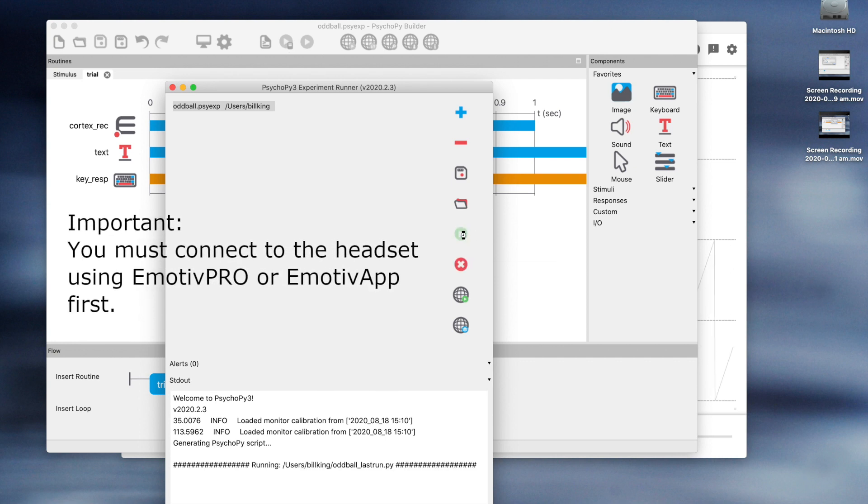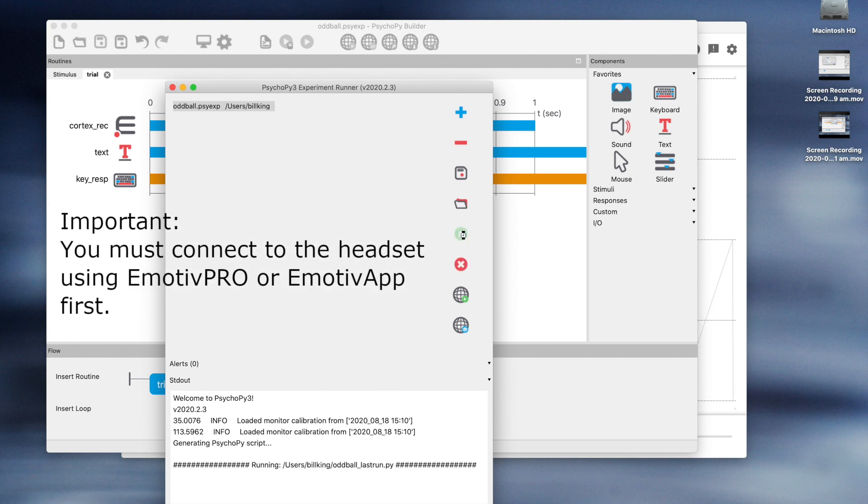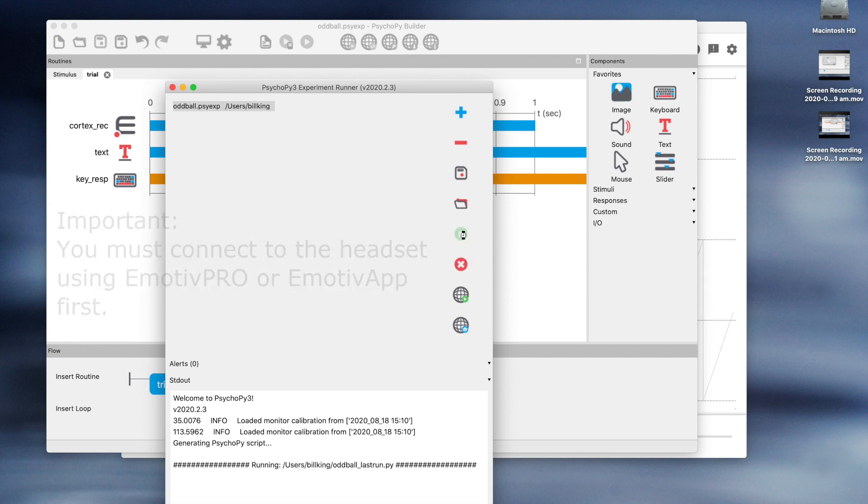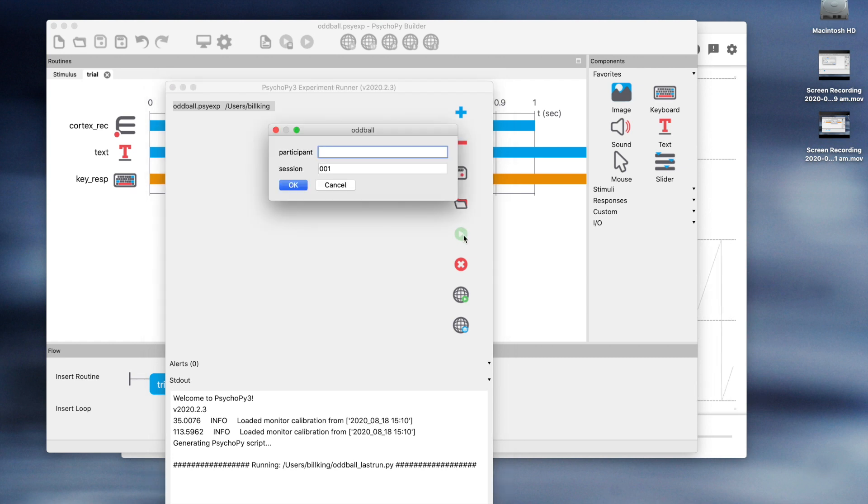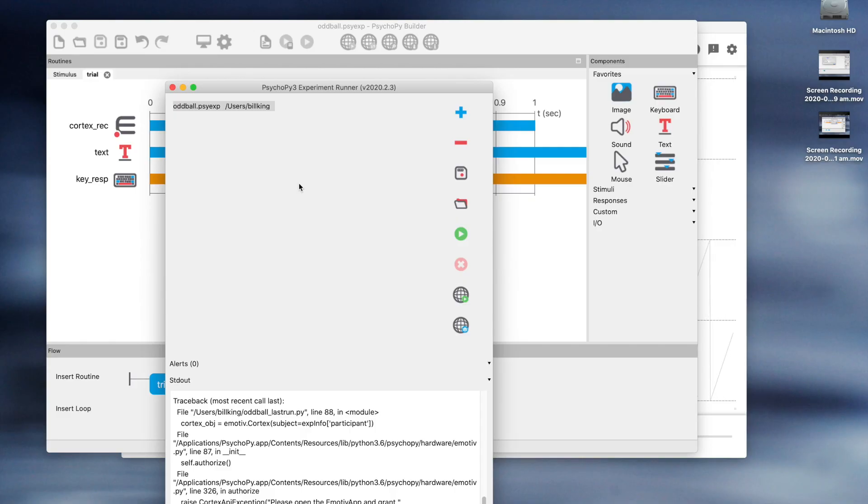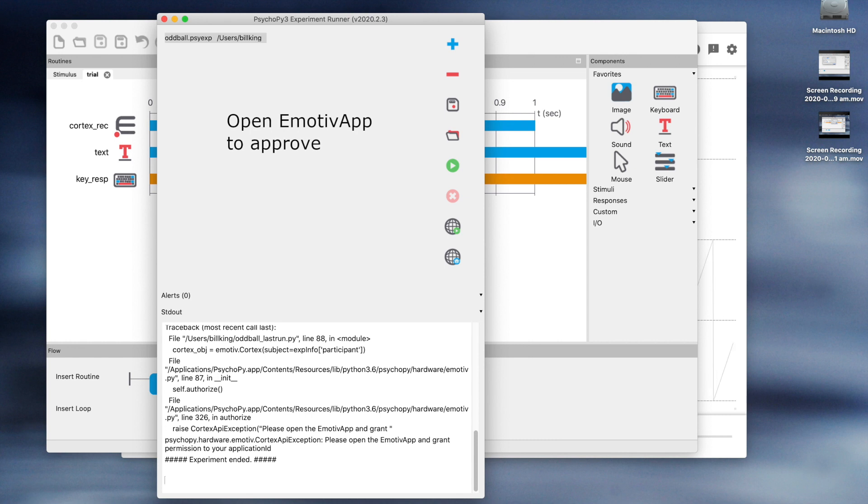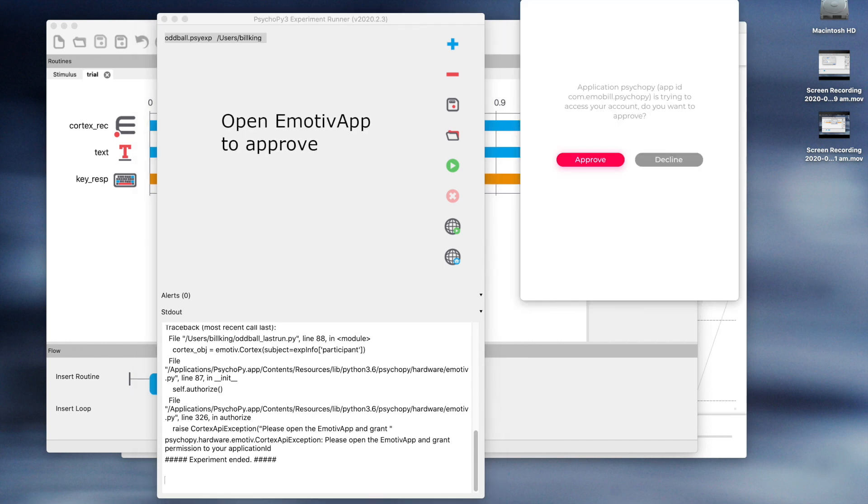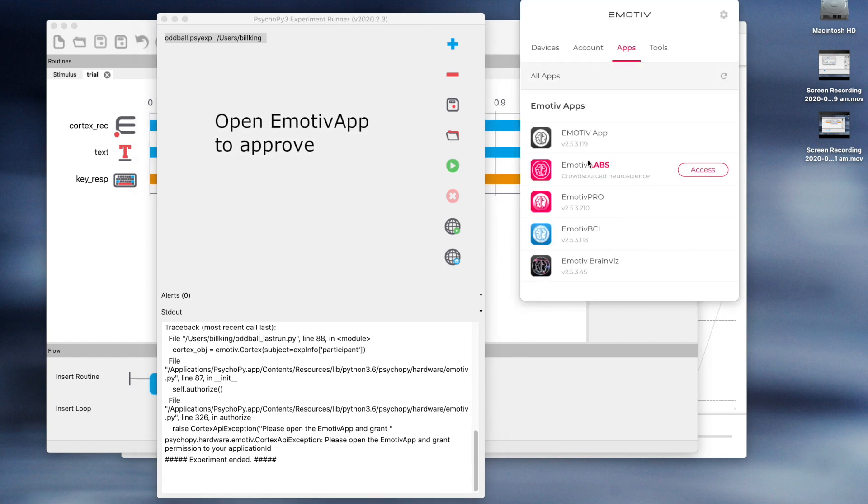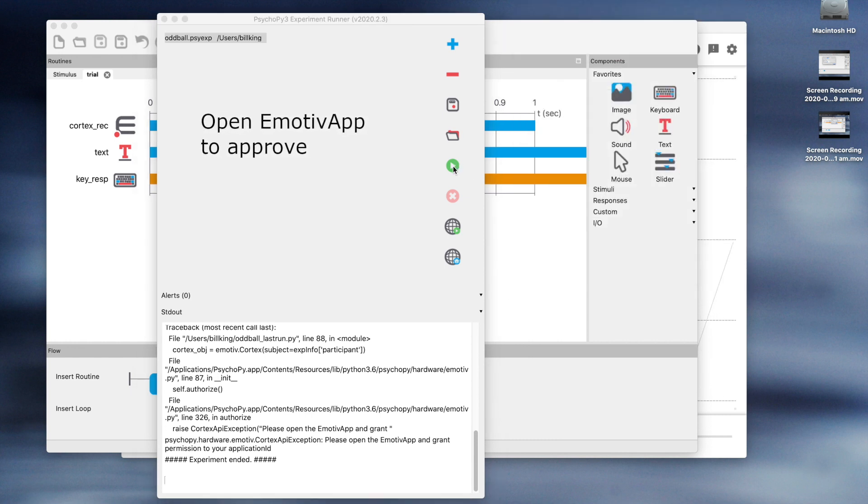Now, the first time you run it, it will not work. You have to give PsychoPy permission to talk to the headset. So open the EMOTIV app and approve the access. Now run again.